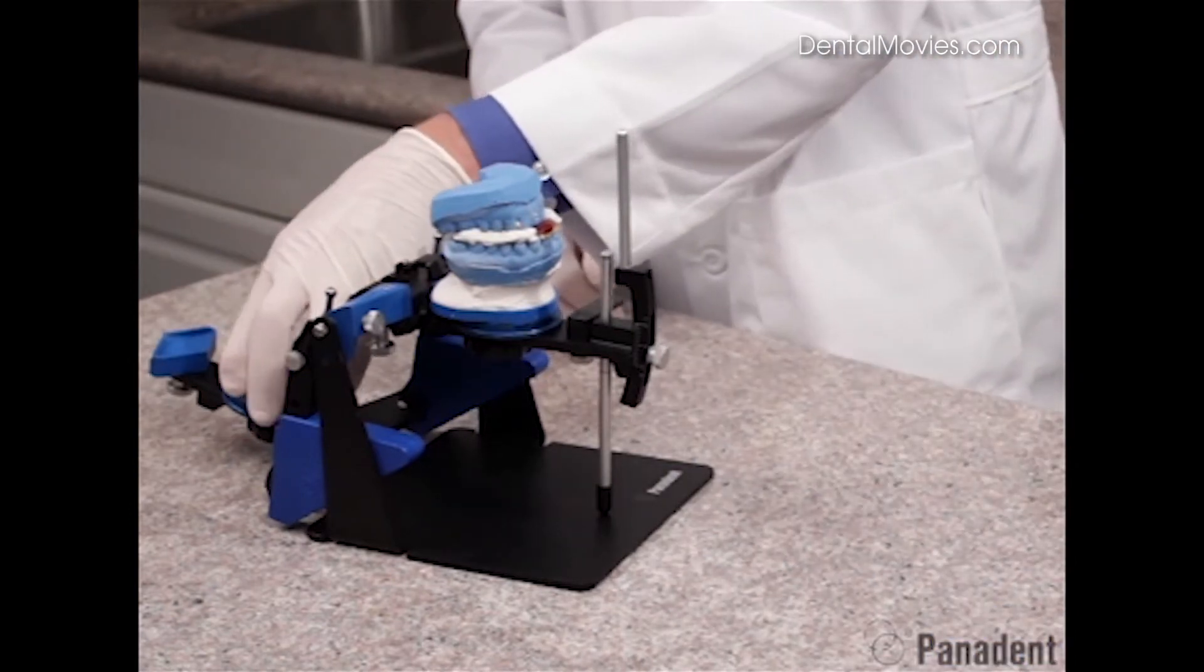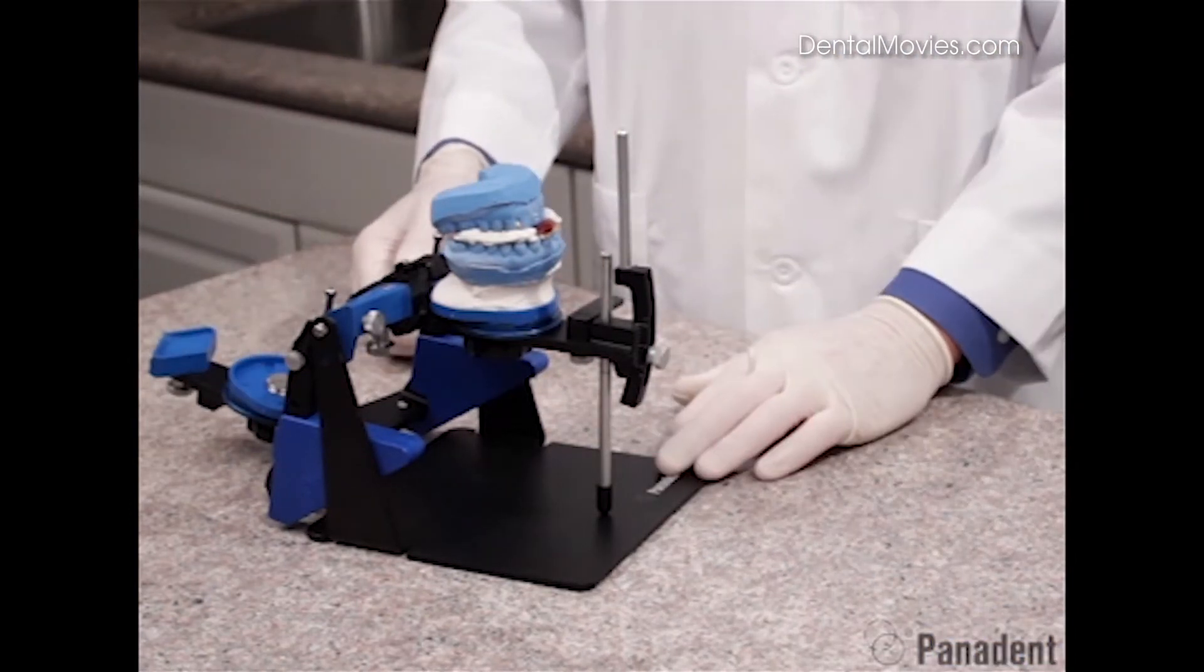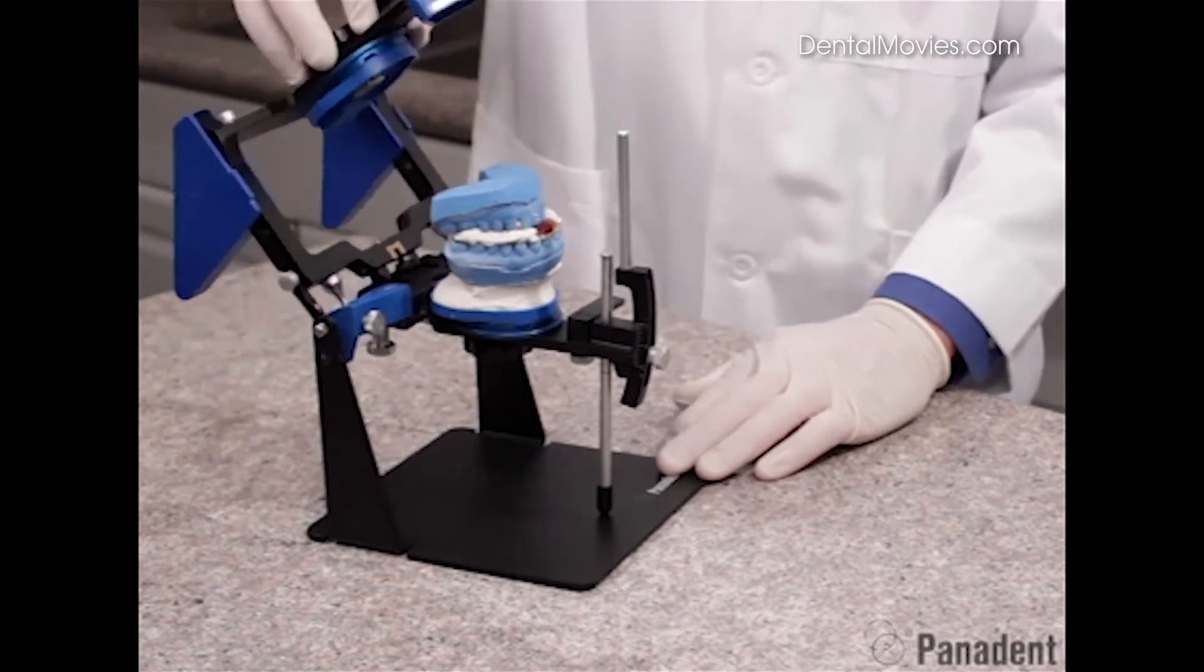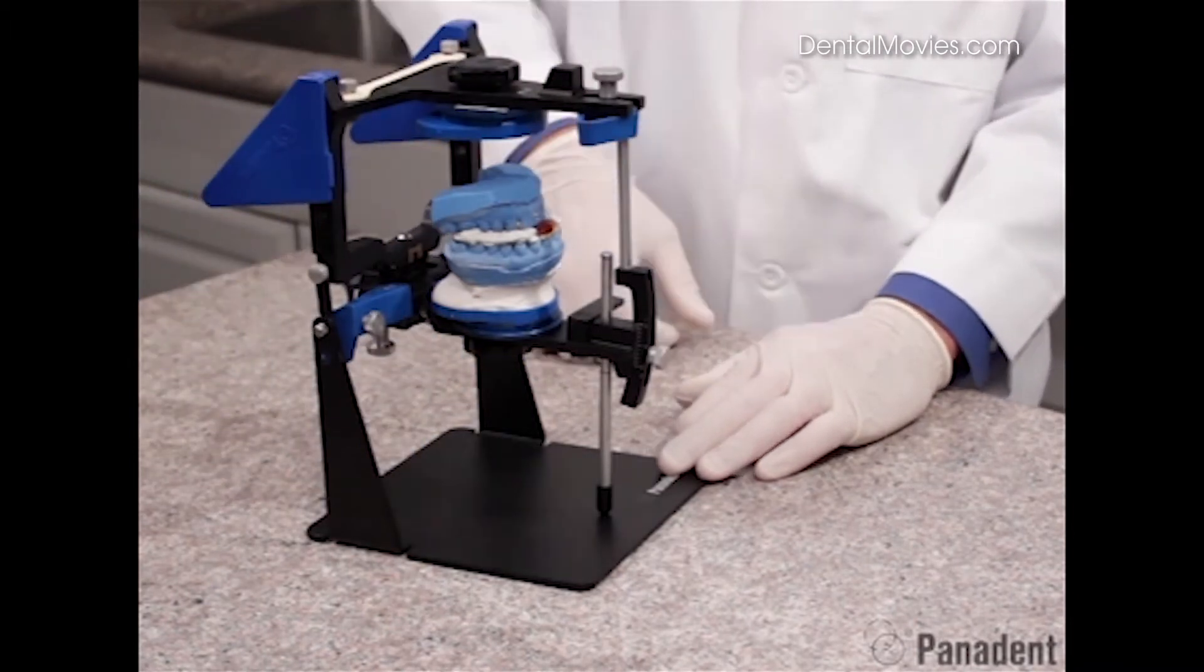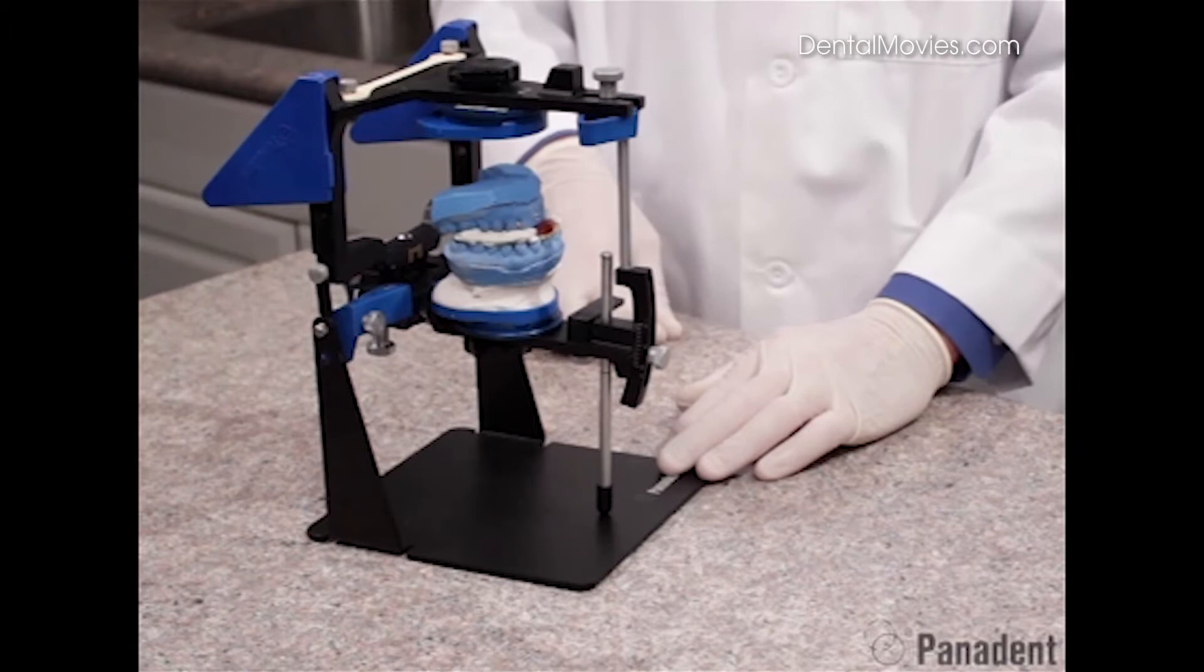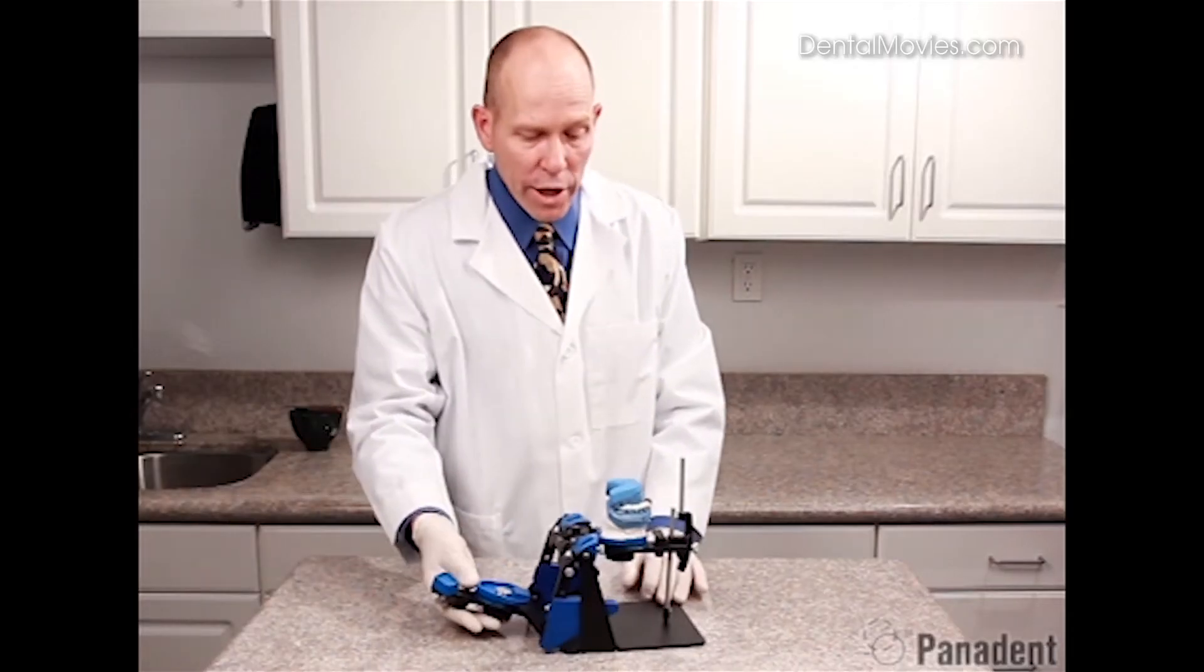We can then add a mounting plate to our lower frame here. We can add some plaster to the mounting plate and to the cast, swinging this around making a connection of the lower cast to the lower frame of the articulator. So we'll go ahead and mix some plaster at this time.